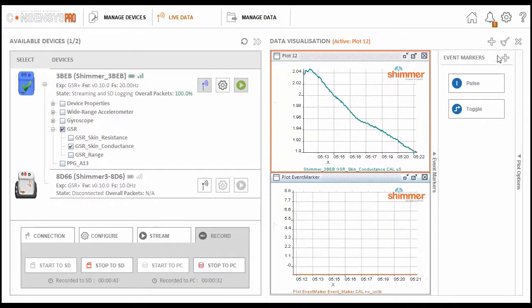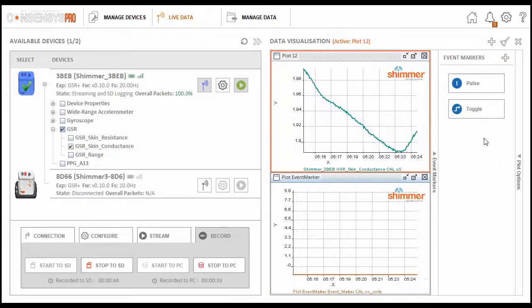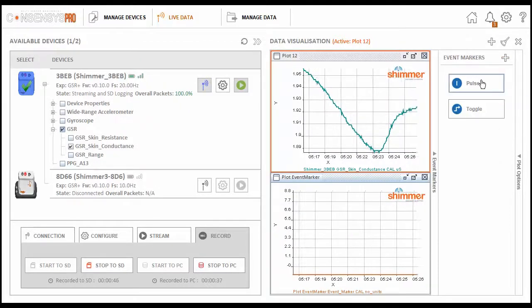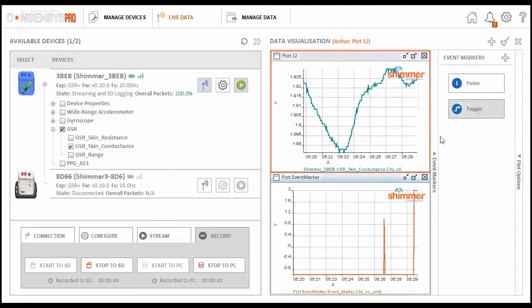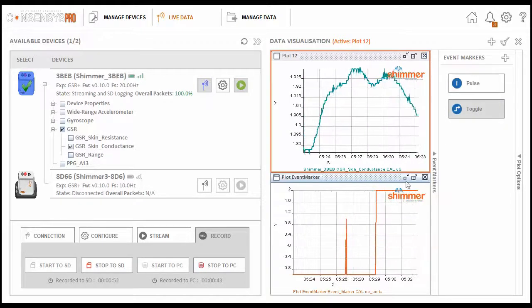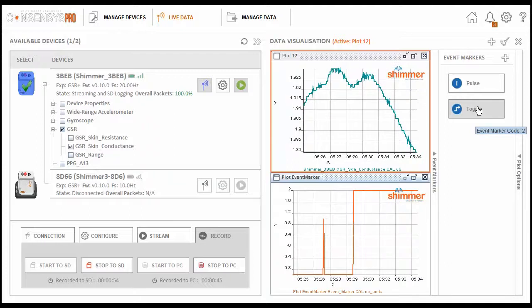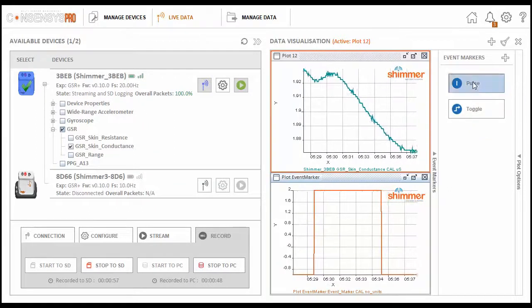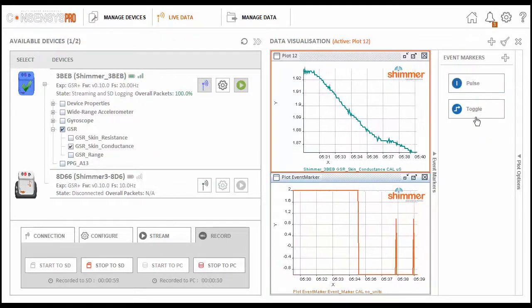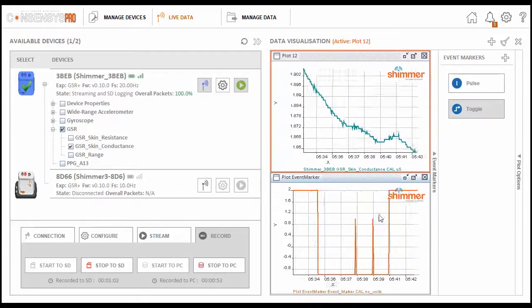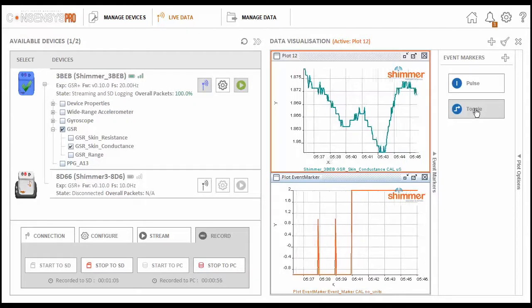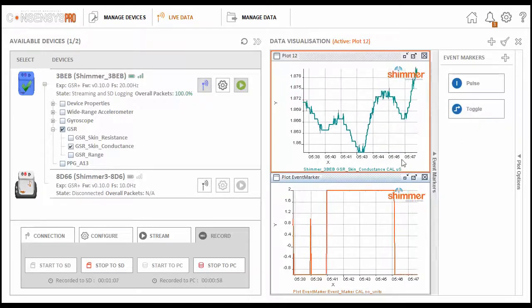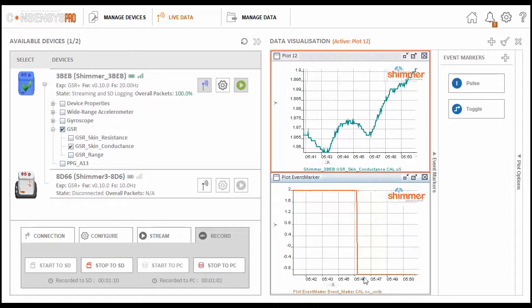Another option when recording live data is to add event markers to highlight moments of interest. You can add the event marker here. There are two types of event markers. The pulse adds a single marker to the data, while toggle sets the event marker over a period that is defined by the user pressing, starting, and stopping the toggle event marker. I'll show a couple of examples here. The pulse is a single marker, as you can see, while the toggle is defined by start-stop. These event markers are time correlated with the data you are currently recording.